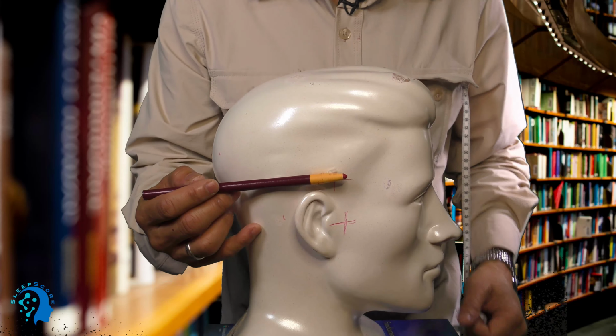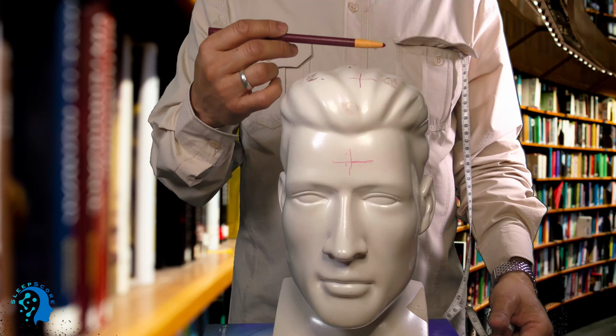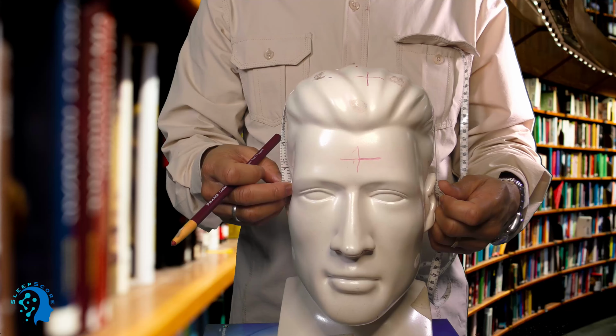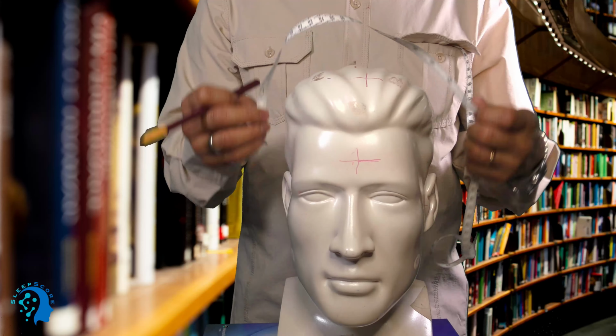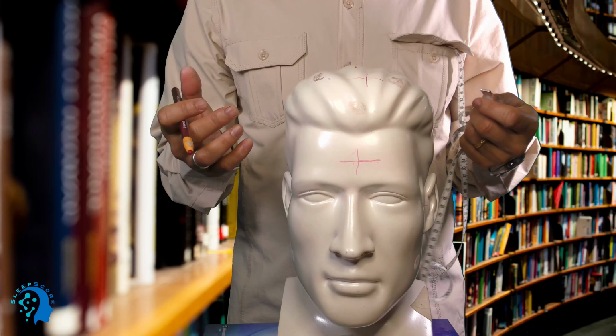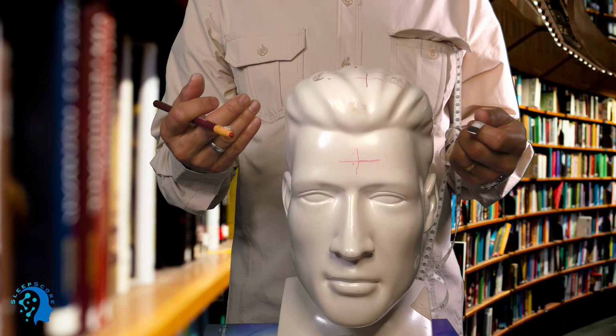Now in that way, we did just like here. When we did this from here to here 10%, then from center we went 20% on either side. And the same way we are going to do the same thing over here too. So we measured this one right here, which was 36, and we have to count 20% of 36. So what I normally do is 36, I double that number to 72, and I go 7.2. So 20% is easy to get: 36, double the number, which becomes 72. So 20% means 7.2.